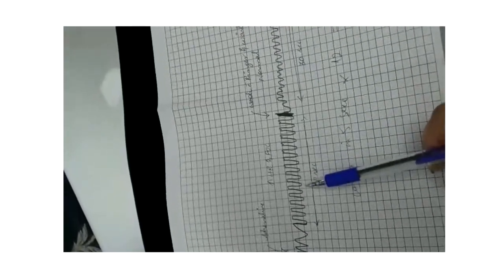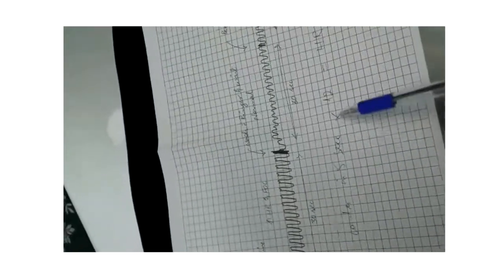So you will count contractions in 5 seconds, multiply them with 12, you will get the heart rate, because 5 multiplied by 12 equals to 60. That means 5 seconds multiplied by 12 equals to 60 seconds. So you will get the heart rate in 1 minute. And the force of contraction will be measured with a scale in millimeters.